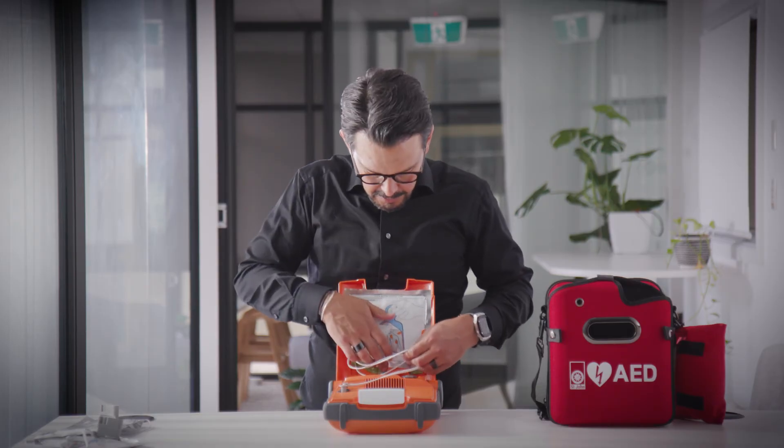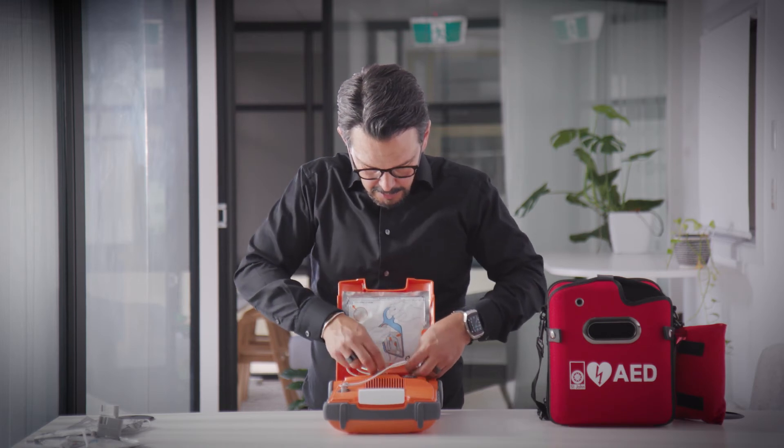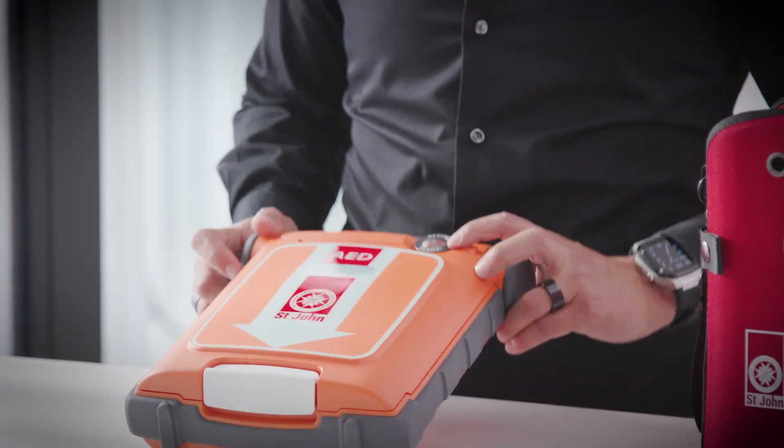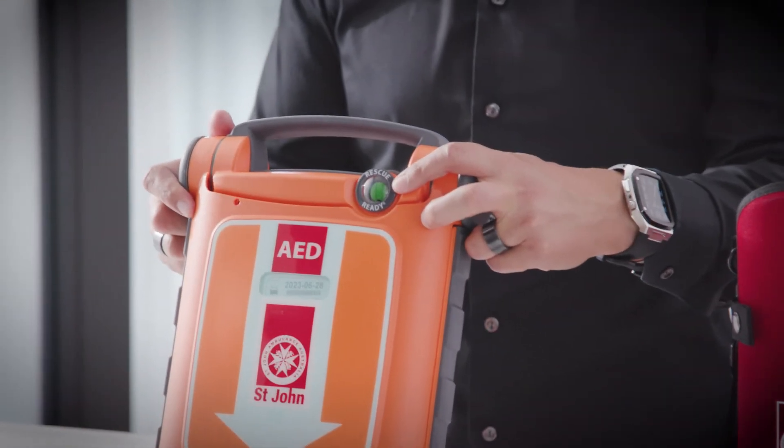Once you place your electrodes in, secure the cords like so and close the lid. Please ensure once you change over your electrodes that your unit is rescue ready.